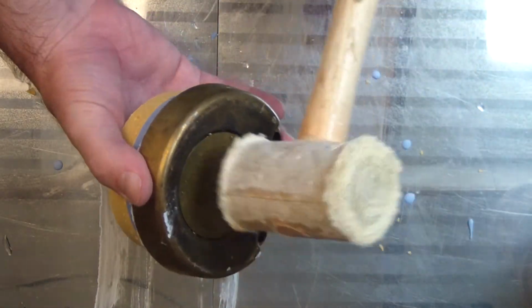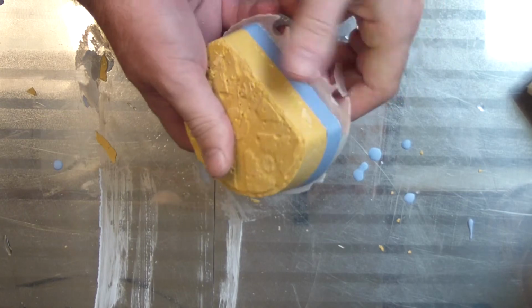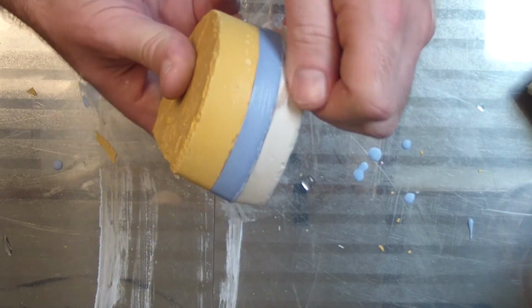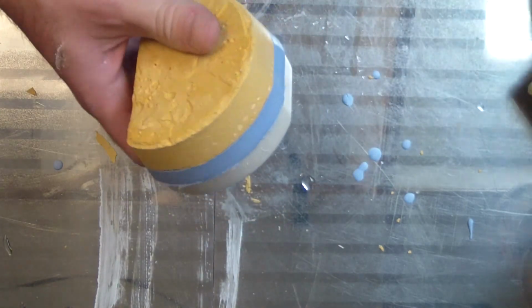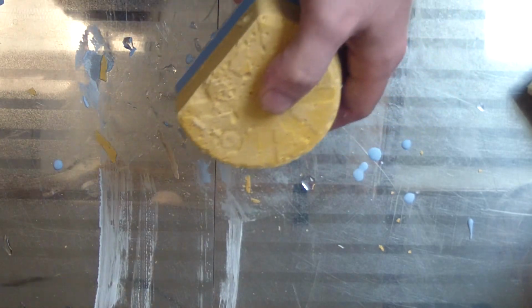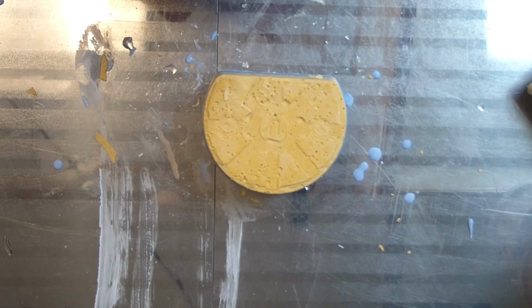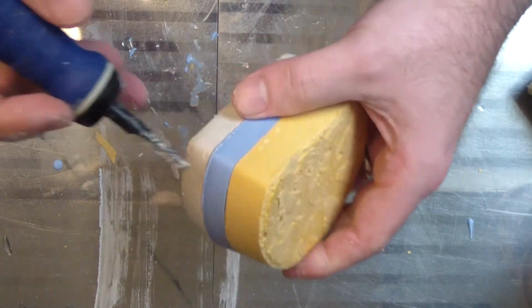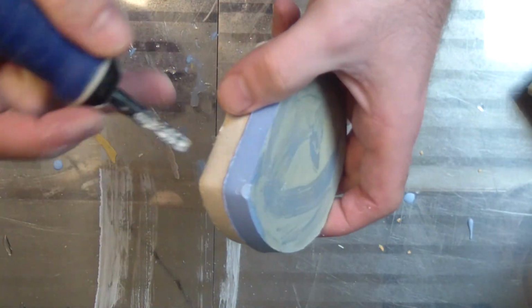And I'll tap on this side. Comes right off too. Pop the disc off. And you can see I did first, second, third pour. You can really see on here because I used three different kinds of colors and three different kinds of stone. So I usually use my Renfrew Pilo 2D flasks. Third pour comes right off clean.